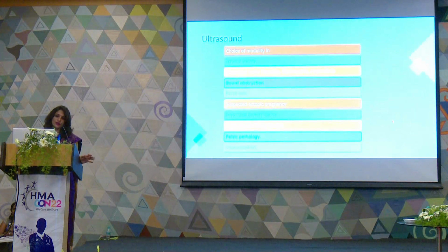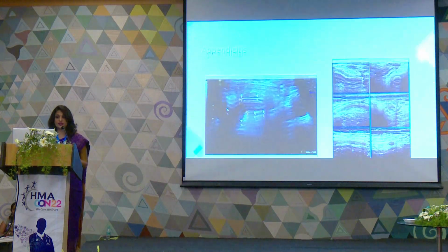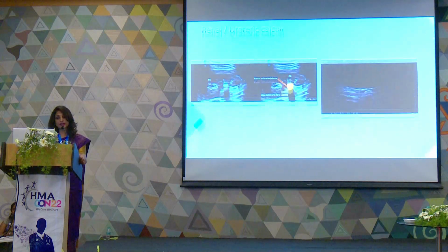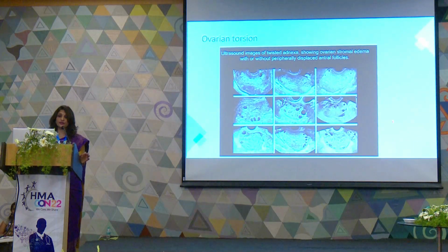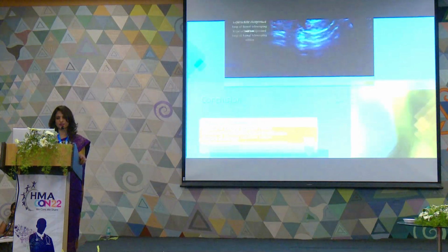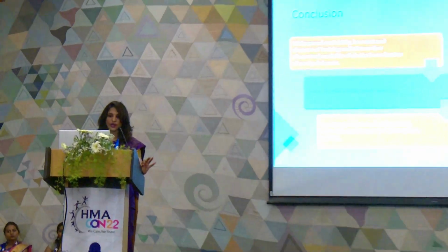It also has some pitfalls. So ultrasound becomes the modality of choice in acute cholecystitis, appendicitis, appendicular perforation, obstruction, ureteric calculi, ectopic pregnancy, if you suspect ovarian or testicular torsion, and also in intussusception. Widespread availability, low cost, and absence of ionizing radiation make ultrasound a choice of evaluation of acute abdomen. It is a choice of modality in pelvic disease, and it is a primary test even if we require CT or MRI later in pregnancy.